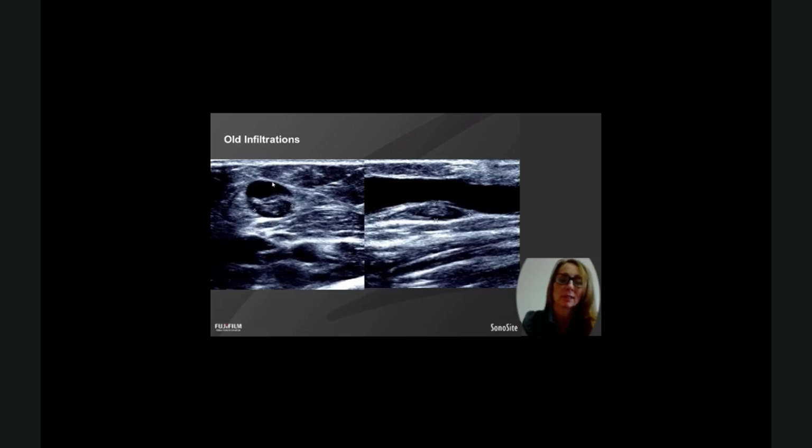And you can imagine that on this cannulation they wouldn't have been successful. They would have possibly tried to change the angle, but because they would have been hooked in this, if they didn't have ultrasound, they wouldn't have realised and they would have probably abandoned. And then the next person who comes along would see that people have been cannulating there from the punctures and probably choose to cannulate in a similar area, maybe puncture here, and then not realise why they can't thread through and probably cut through this again and make this infiltration even worse.